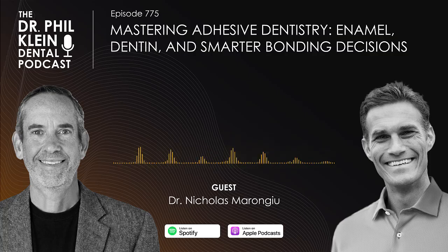Yeah, and I think this is another indication why it's important to stay within the same system, Doctor, because when you're troubleshooting, if you're not staying within the same system, you're now thinking, is it an incompatibility issue between the materials that's causing these things to debond or cause sensitivity where we're getting gaps and so forth? But when you're using the same system, you're relying on the company who's doing the research and development to say, if this was done ideally, these materials working together should give us the best optimal result, and it should be predictable.